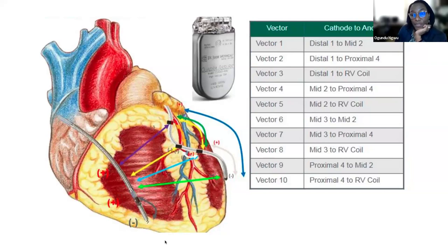But it can be very painful in the lab when you finally get into that vessel that you've struggled to reach, you've done an inner, and then you get there and it's all phrenic nerve stim. It can be very painful. But again, if there's a reasonable difference between them, as Dr. Shaw said, I absolutely will take that vessel if that's the one that I think will give me the best anatomical position. If the phrenic nerve is capturing at 4 and my threshold is 1, I don't move from that vessel. I take it and I keep it.